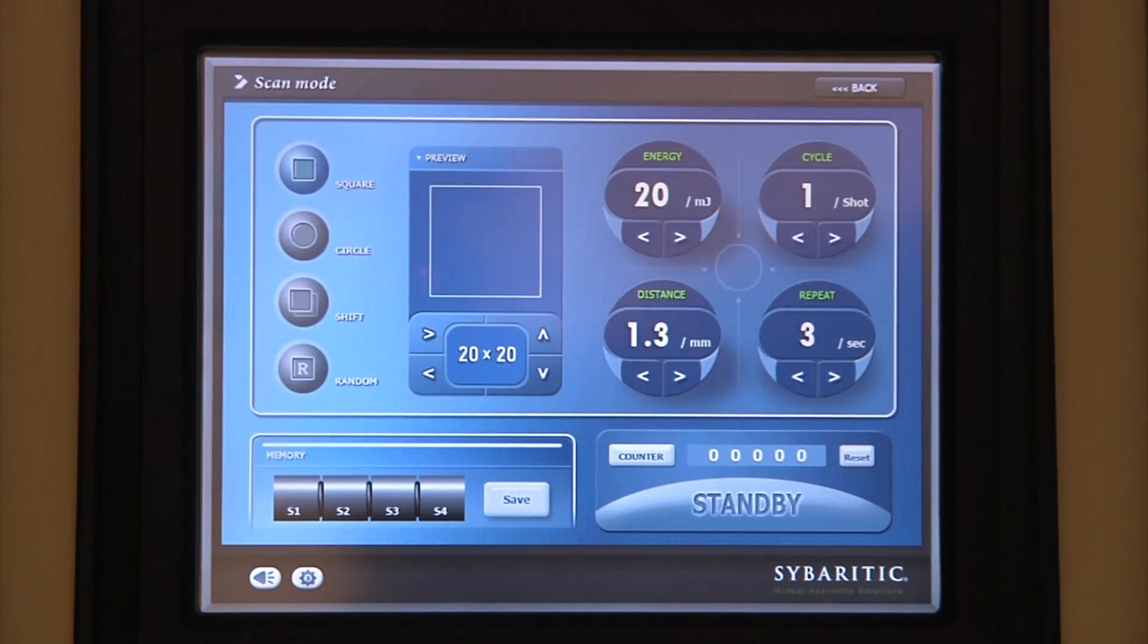Yet another indication for the DeepRenew Elite CO2 laser is for anti-aging, the treatment of wrinkles, as well as skin texture. In these cases, we actually choose a moderate spot density, and we can alter our energy as needed to have deeper treatments.